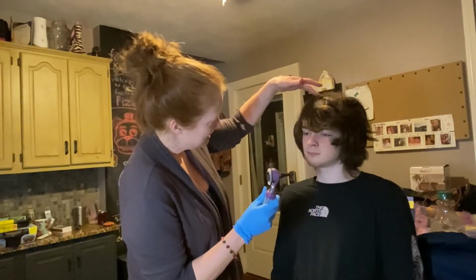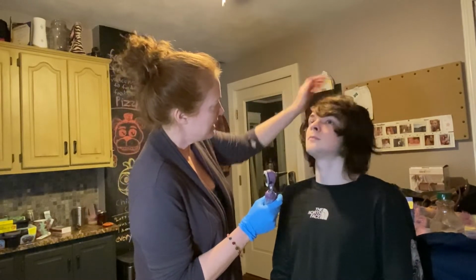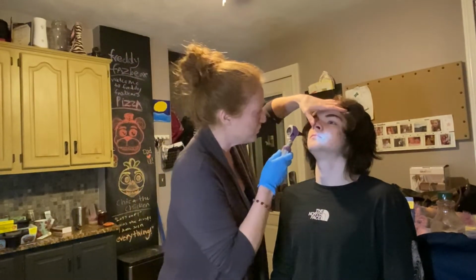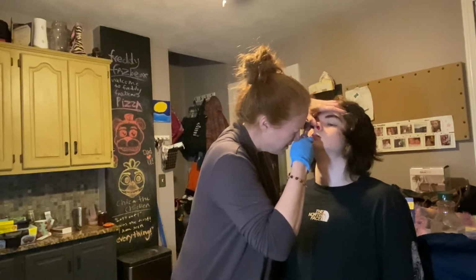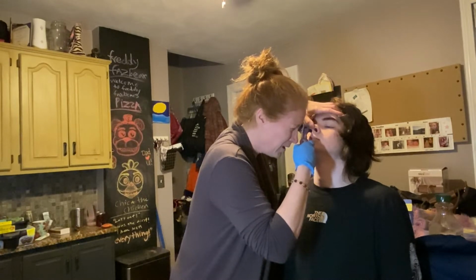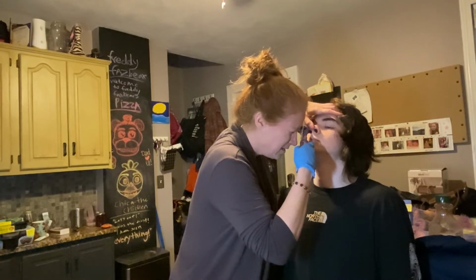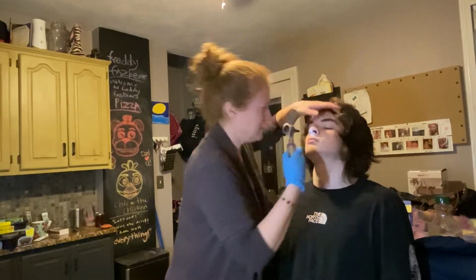Next, I'm going to inspect inside. Might be a little bit uncomfortable. If you can just tilt your head back slightly, and I'm just going to push up on your nose, and I'm going to inspect. Turbinates are normal. I see no polyps. It is red mucosa, no drainage noted, and septum is normal.